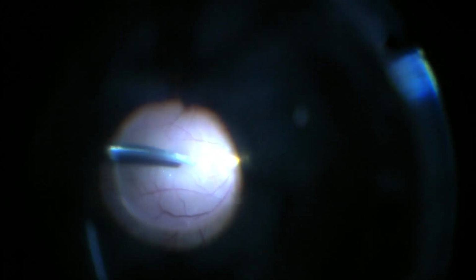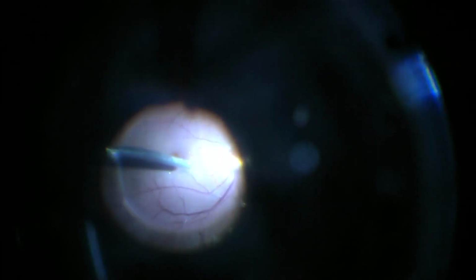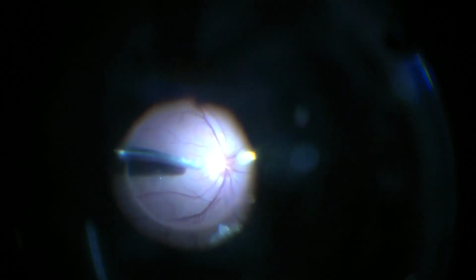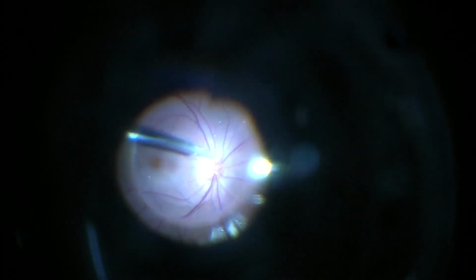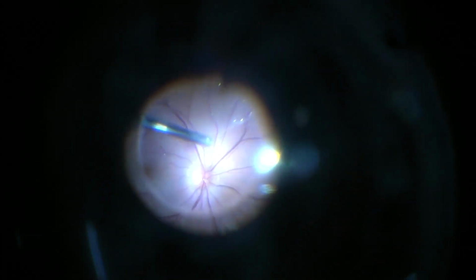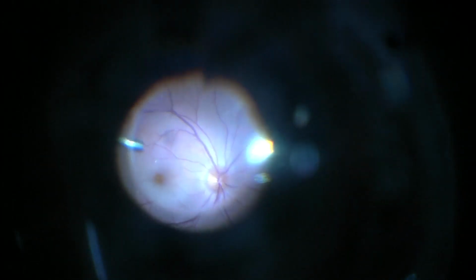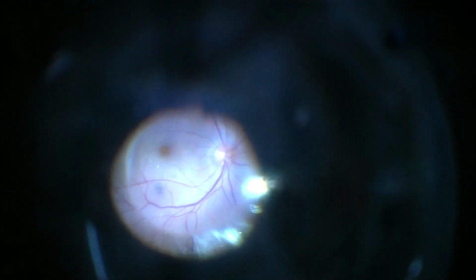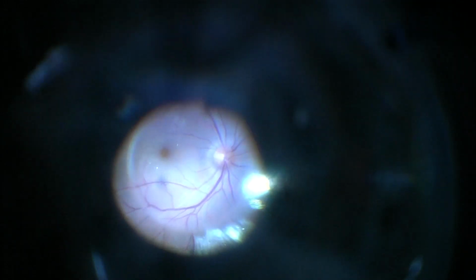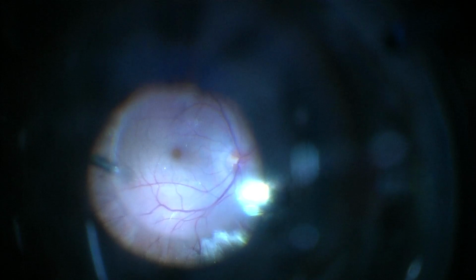Here we can see this process where the vitreous is being disengaged from the retinal surface, and this has to be done starting from the disc. You move on and keep on detaching the vitreous surface from the retinal surface. Once this is finished and vitreous has been detached completely, we can remove it by using the vitrectomy cutter, so that now the retinal surface is bare without any vitreous strands or any membrane over it. This excludes the possibility of later macular pucker or any tractional detachment.